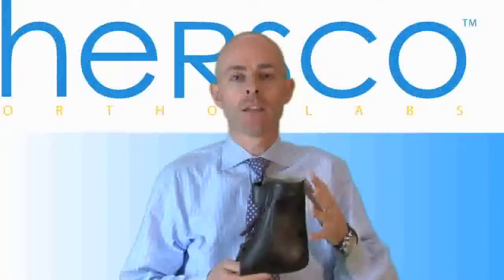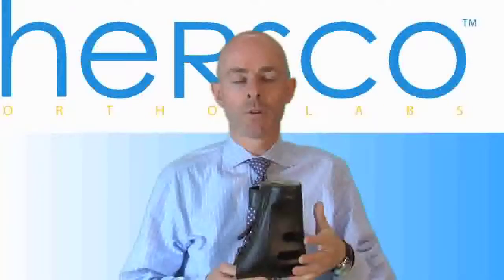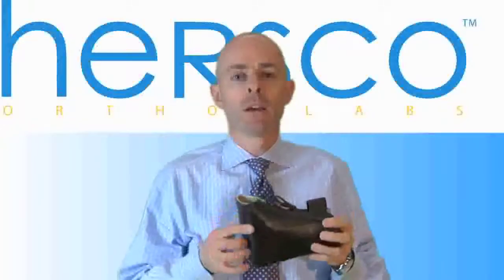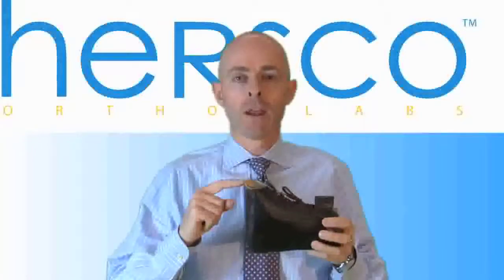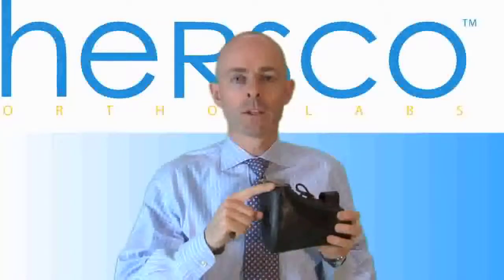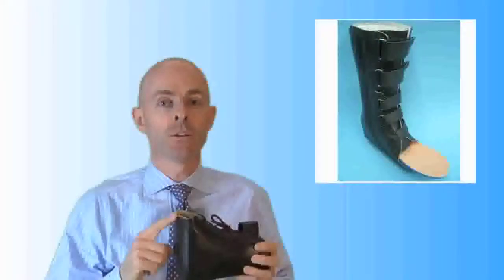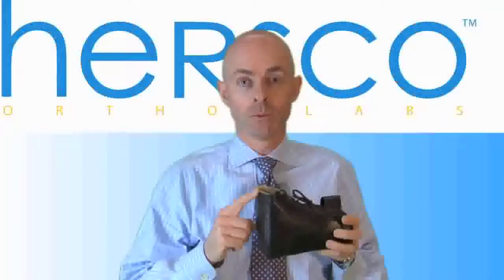The classic design is 6 to 8 inches from the ground up to the top edge of the device. Typically, I like to recommend that it goes to the metatarsal heads, perhaps to the sulcus. It can go full length, but then you can run into issues with the fit inside the shoe itself.